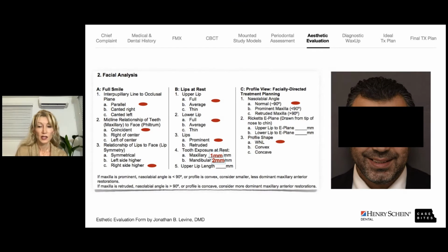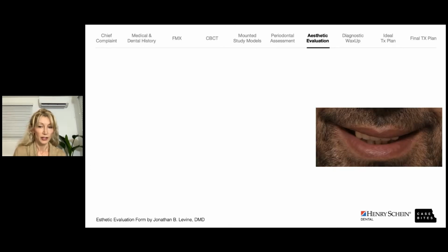Lips and face, on the right side, we can see his muscles retract the lip a little bit more than the left side. However, he has less teeth on that side, so it's possible just how the soft tissue fall in place. In terms of lips, pretty full lips, normal exposure, maybe a little bit on the deficiency. In terms of profile, within normal range.